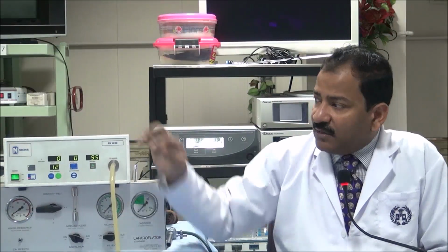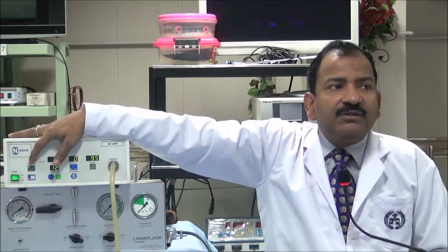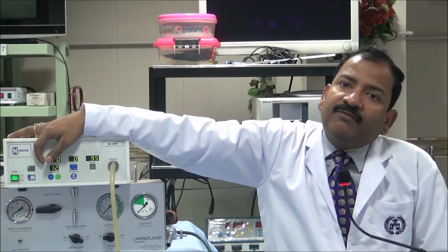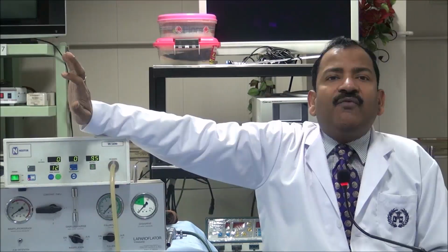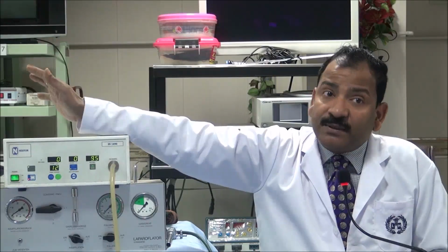Yes. So the maximum capacity of the pre-peritoneal pocket to take gas is 1 liter at 12 mmHg pressure. Once you put 1 liter of gas into the pre-peritoneal space, after that the flow will stop. It will become 0, because now no further stretch or detachment of the peritoneum is possible.